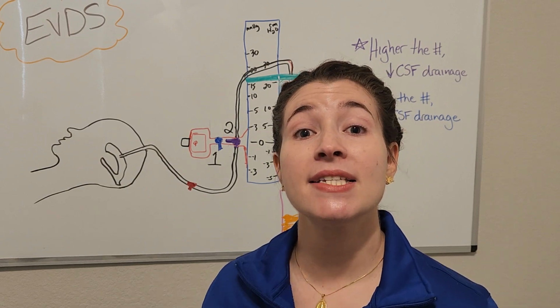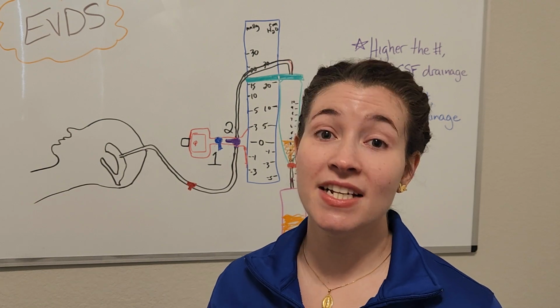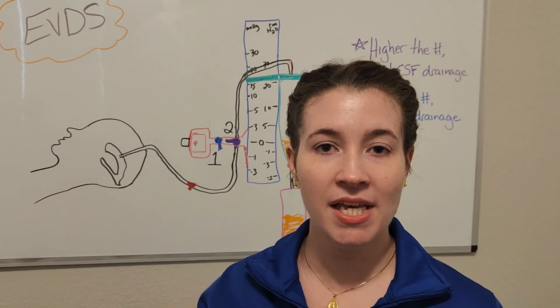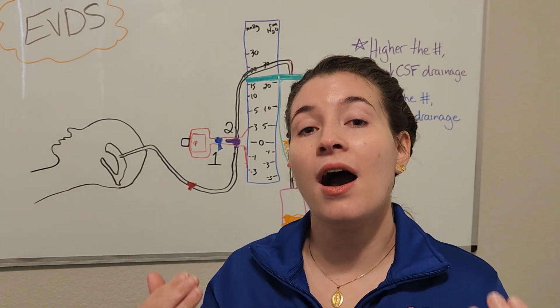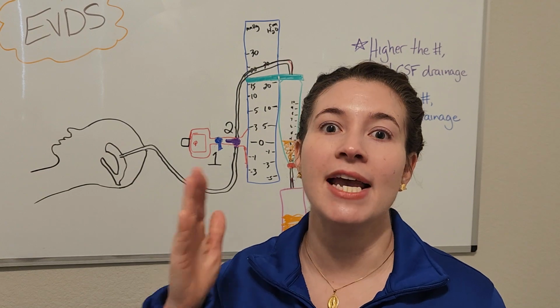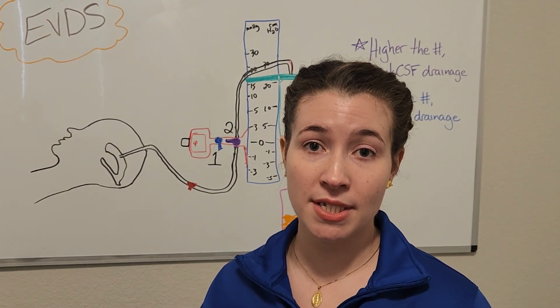Now, an EVD is placed to help drain off CSF in an attempt to lower the pressure, or the ICP, in the brain. The higher that ICP is, the less likely blood is able to circulate, and that can really put the patient at risk for ischemia.